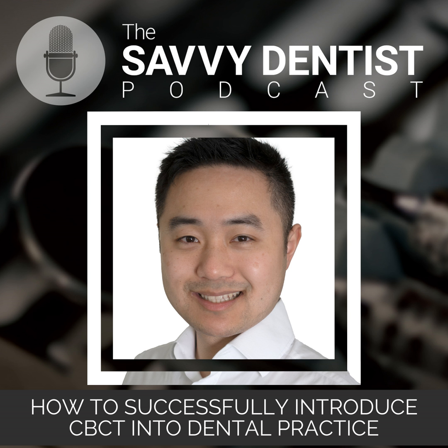So just to give you a bit of a reference, this is going back to a bit of radiation 101. The measurement of radiation harm dose is a unit called sieverts. You might see that when you read the brochures about CBCT machines and the amount of radiation. So what a sievert is, it's a unit that takes into account the energy of the radiation, the type of radiation, but also the susceptibility of the target being irradiated.